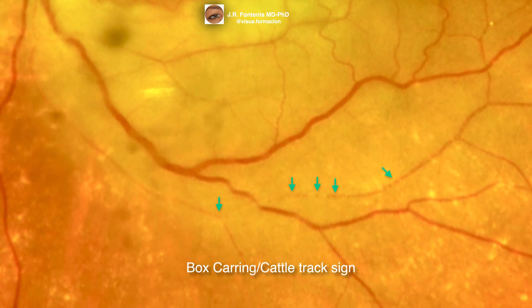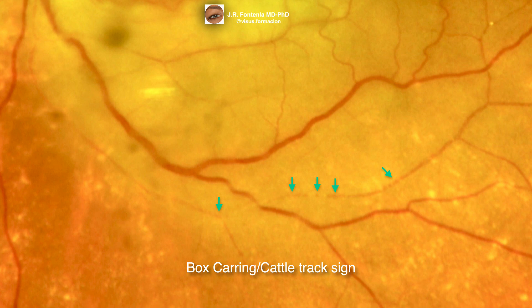Here we see a very characteristic sign of retinal arterial occlusion: fractionation, the intravascular fragmentation of the blood column. We can see bloodless areas that alternate with areas where the vessel still has blood content. This sign is the boxcar, or cattle track, sign.